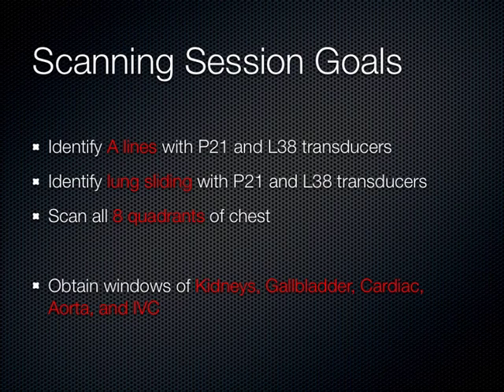And with what time you have left, practice your views of that pleural space. Look for fluid in the pleural space, Morrison's pouch, splenorenal recess, and anything else that you feel like you need to review, because you'll have extra time today. Any questions?